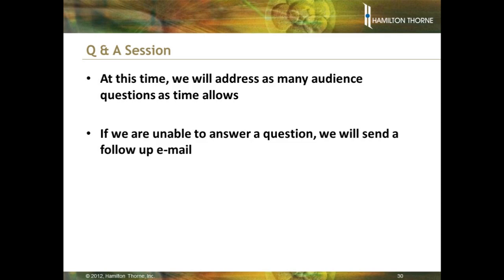I know not everyone agrees with me, and I respect other opinions, but in my hands, if we knew that freezing was standard, like every time you froze you were going to get the exact same result, then I would argue that maybe freezing would not be as much of a problem. In addition, no matter how good your freezing is, patients' material have different cryo tolerances. So there may be 2 people with the same quality embryos. One survives 100% and one survives 60%. So again, there are too many unknowns, too many variables to argue that freezing should be the standard for everyone.